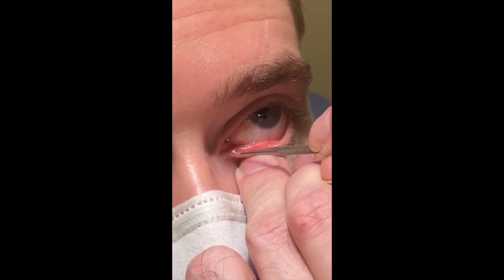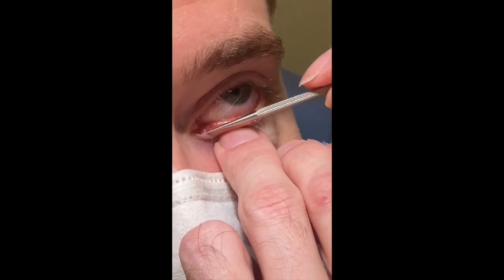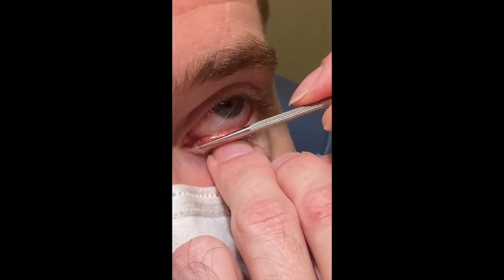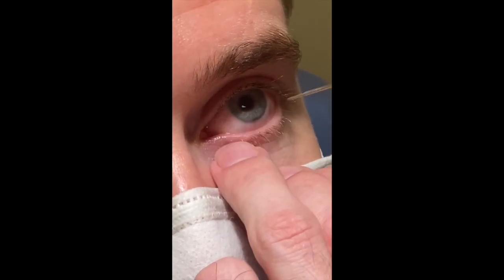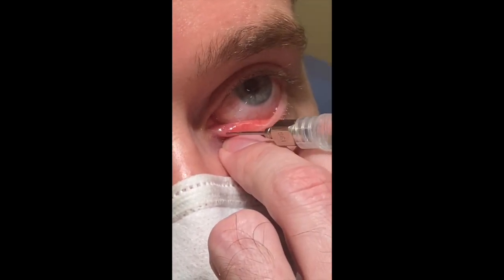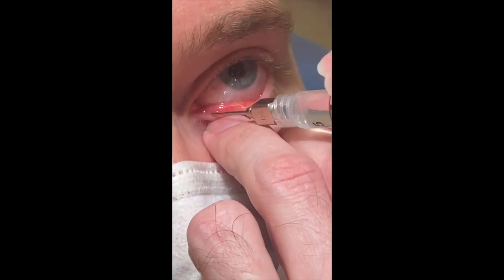Finding the punctum can be difficult. I try to use the largest dilator I can get into. Sometimes I have to start on one side then use the other. A small circular motion helps dilate the punctum a little bit easier. The fingers are used to stabilize the syringe and the cannula.